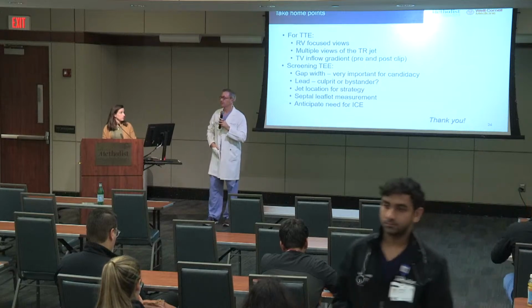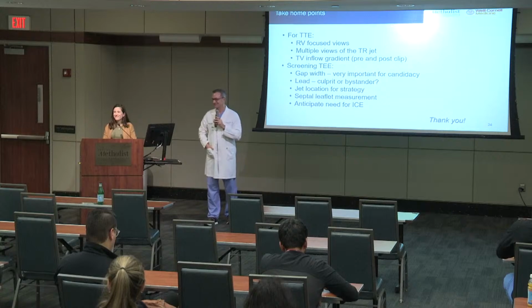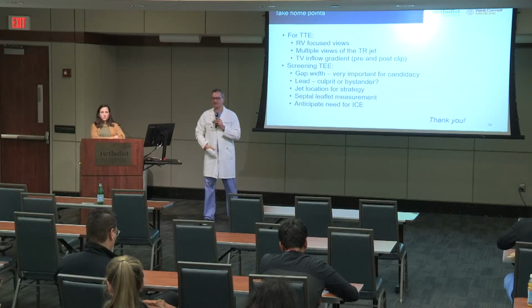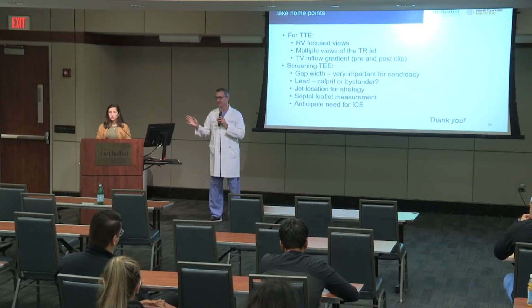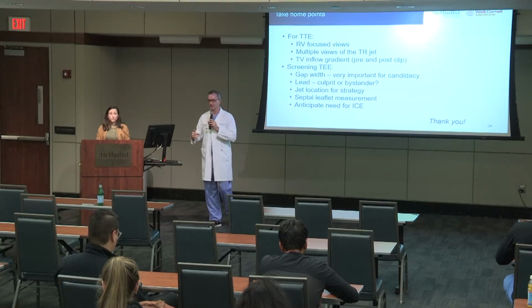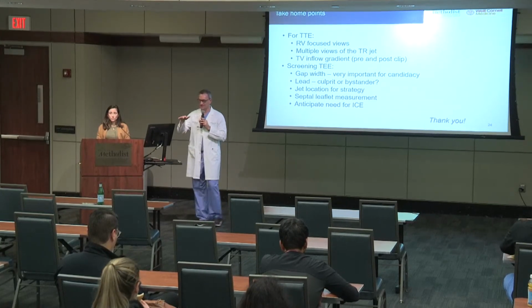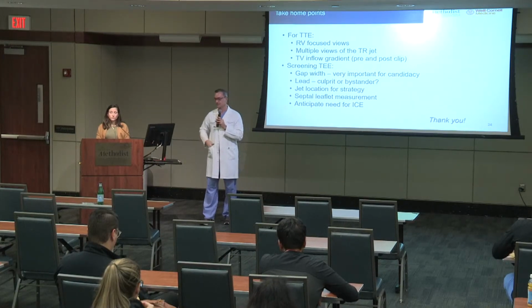One very practical concern is the chairman wouldn't like it. It's a $3,000 add-on. The 3D ICE catheter is roughly $3,000, single-use disposable, with no additional code for it. So it comes out of the DRG. It's a huge added cost for every case. If a procedure is marginally positive or even slightly negative, it becomes definitely negative and more negative. So it's a big cost issue for one.